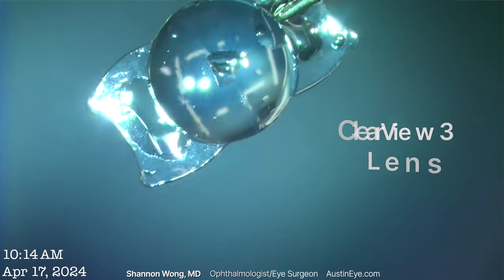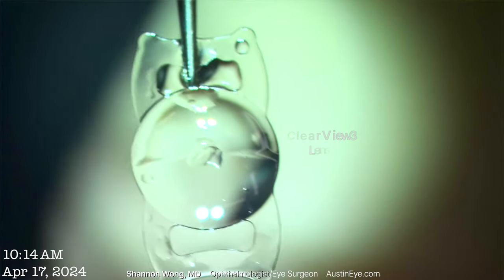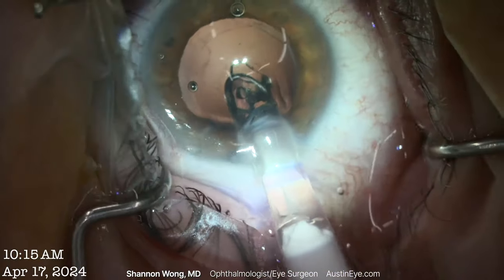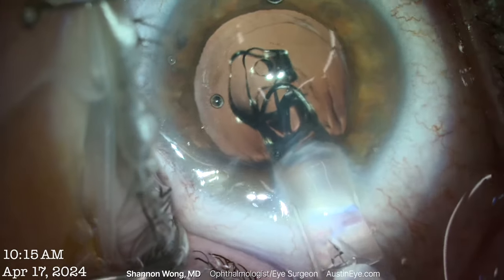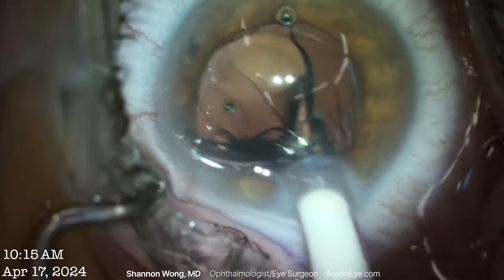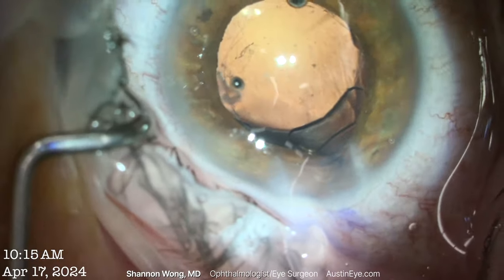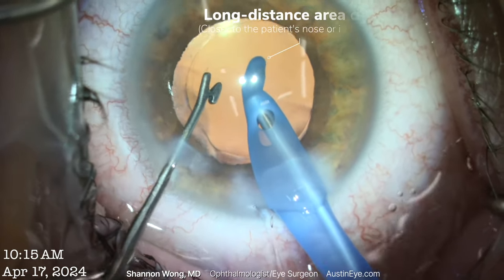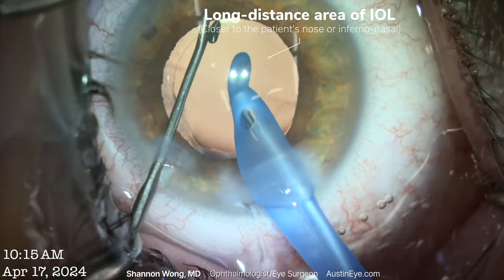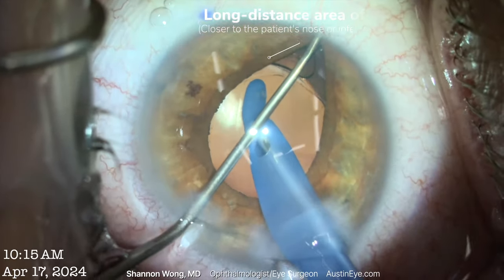Looking at the orientation — this would be how I'd deliver it, in this orientation here. The Clearview lens is then inserted into the capsular bag through our original 2.8 millimeter incision.